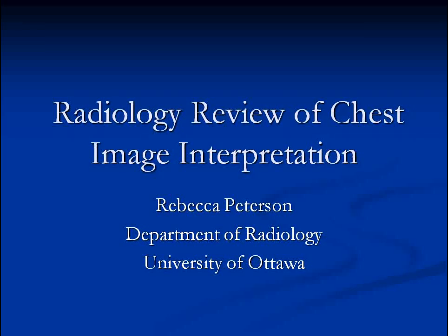I'm going to talk a little bit about the review of chest interpretation as we see them on films or images that we take in our digital atmosphere.